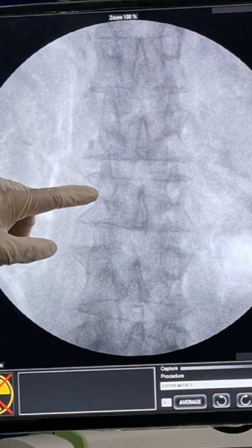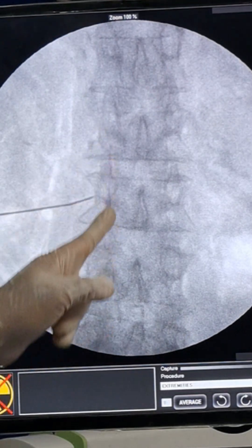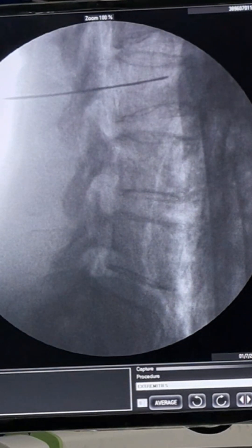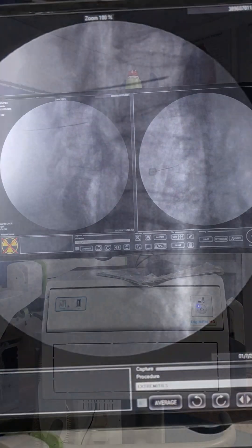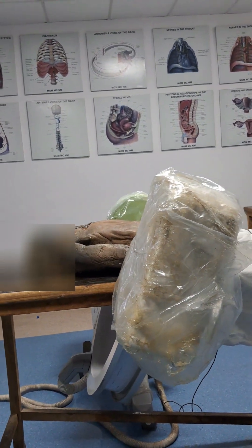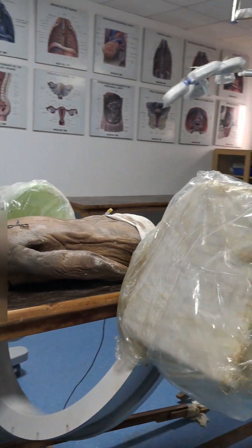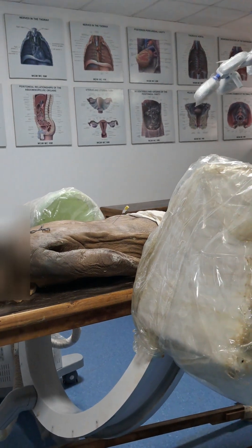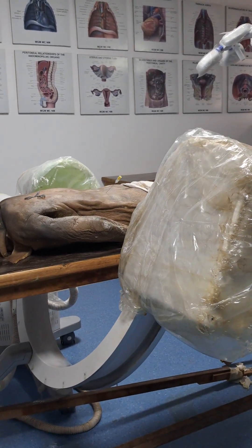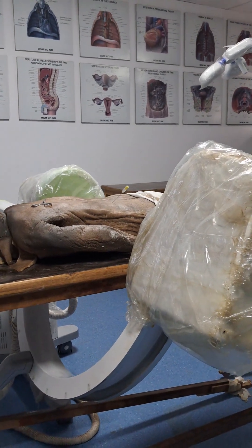Now in the lateral view, I will see where the needle is and take the final position. The needle should reach the facet line in AP view. At the lateral border of the vertebra, I advance to the antero-lateral body. An important point: in lateral view, the kephalo-caudal obliquity should not be changed from what was set during squaring. Whatever kephalo-caudal angle was used to square the vertebra must be maintained in the lateral view as well.